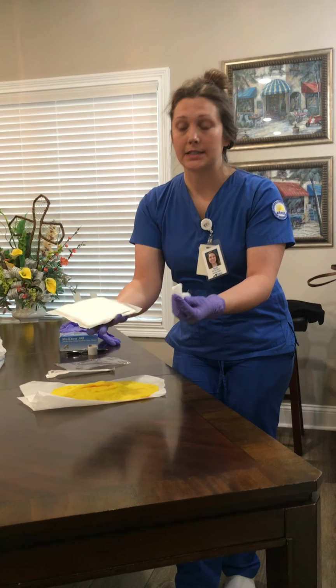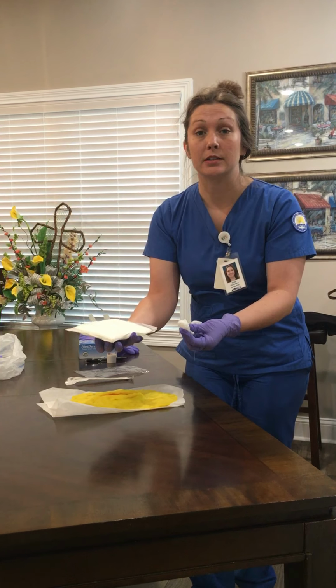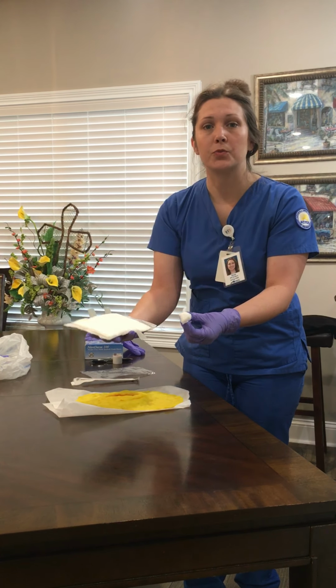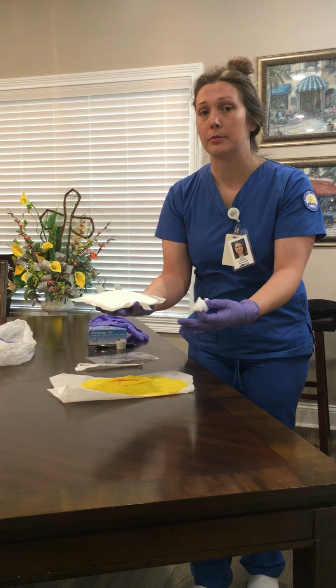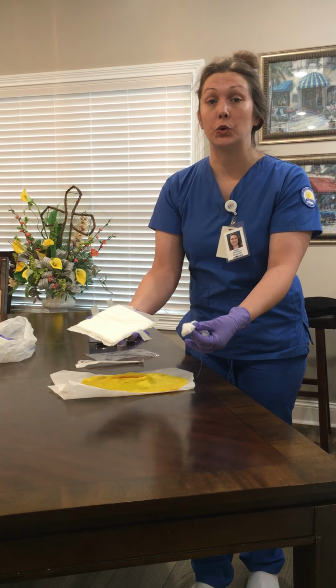So first you're going to assess the dressing itself and the packing. You want to see if there's any drainage present, and if so, what about it? How much is there? Is there a significant amount to where we need to weigh it? What color is it? Is it serous, sanguineous? Is it purulent? Is there a sign of infection? And is there any apparent odor?